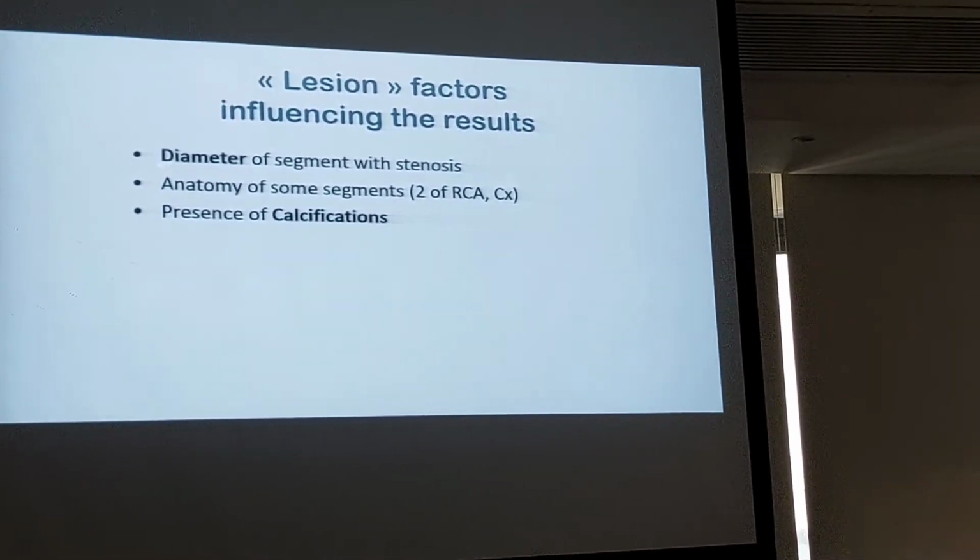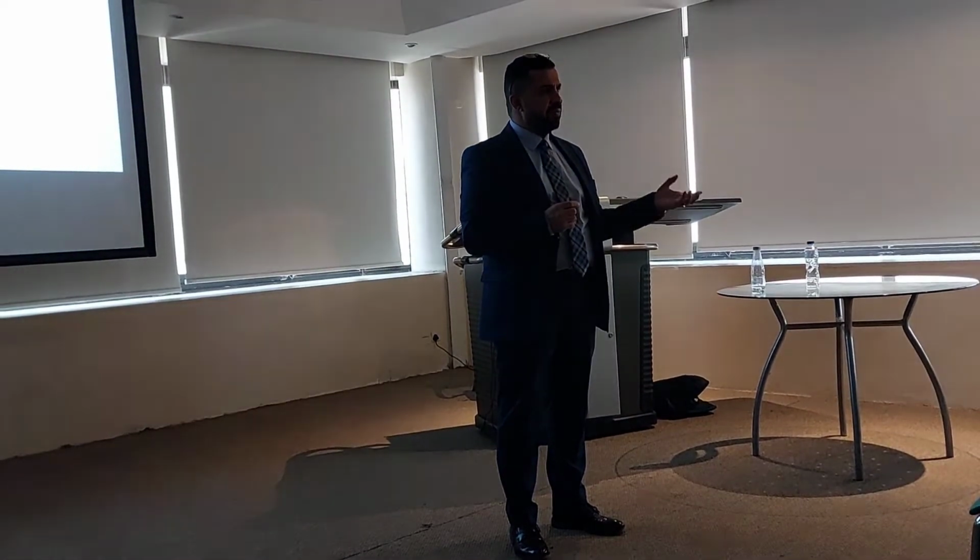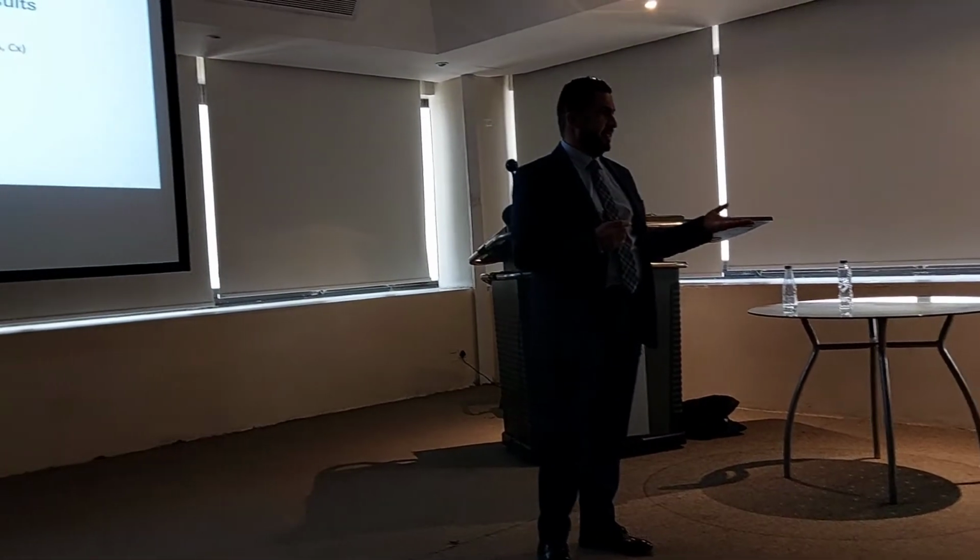Now, calcification will make it a little bit more challenging for us because calcification has a high CT number, so it's causing blooming artifact. Blooming artifact is one type of beam hardening artifact in CT scan physics. It means the calcification itself looks bigger than its real, actual size. So the stenosis looks more severe. So it's overestimated if you don't consider this. The CT will be overestimating the lesions if you are not considering this.